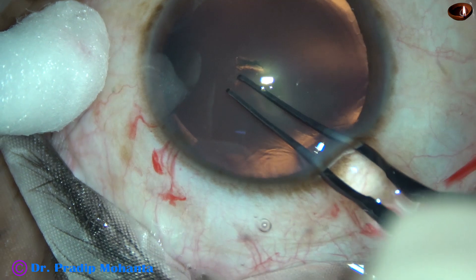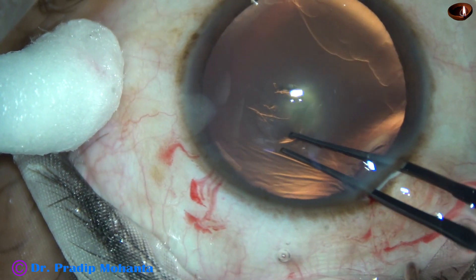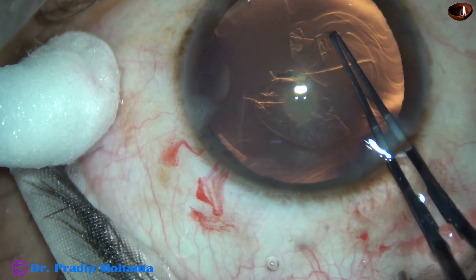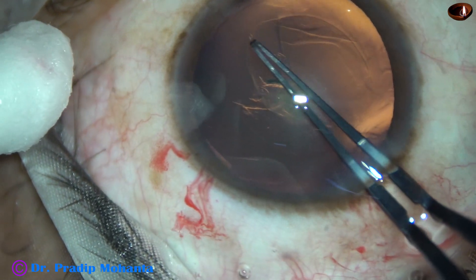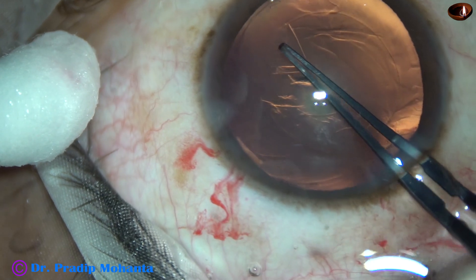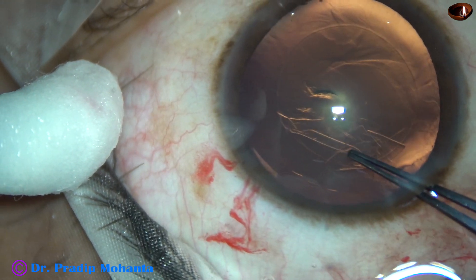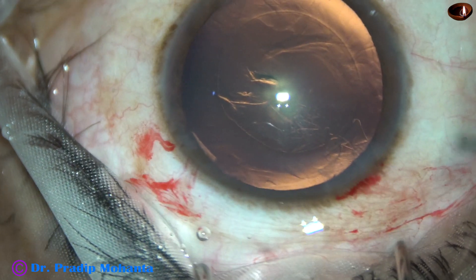Now capsulorhexis is being done. With the help of a Utrata forceps, a capsular tag is raised. This capsular tag is guided anti-clockwise all around to get an adequate sized rhexis of about 5 mm.